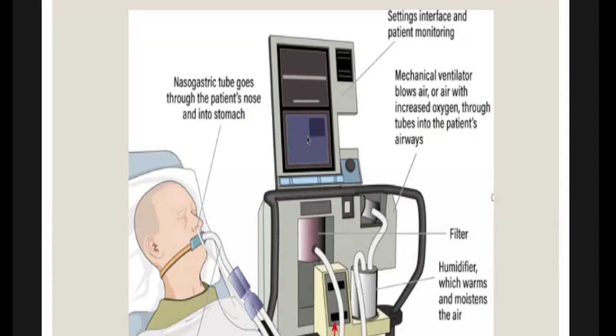That's why you have a lot of numbers on the ventilator, which is not to confuse you all, but to show how much is being set up and how much is being delivered. However much we set up, it doesn't matter unless the patient gets it. Although we set up a lot of numbers, depending on the patient's lung compliance, the patient's airway resistance, and the pathology behind the lungs, based on all that, the delivery will be impaired.